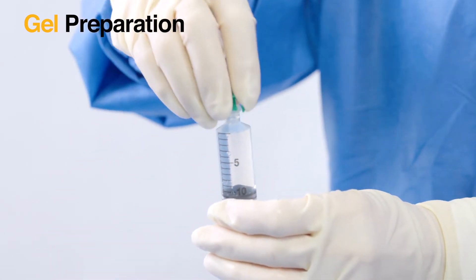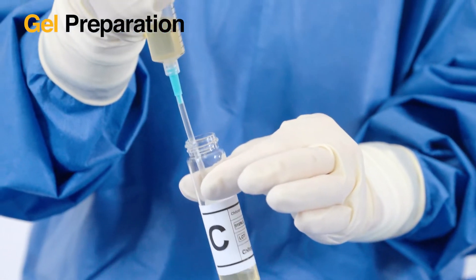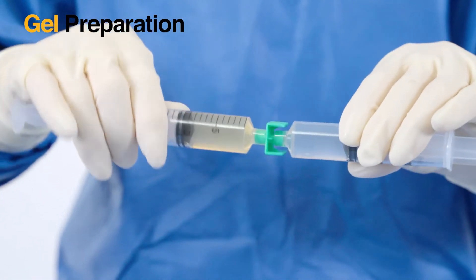Then attach the green fluid dispensing connector. Using the second mixing cannula, aspirate 11ml of C into the second syringe. Then attach the two syringes via the fluid dispensing connector.